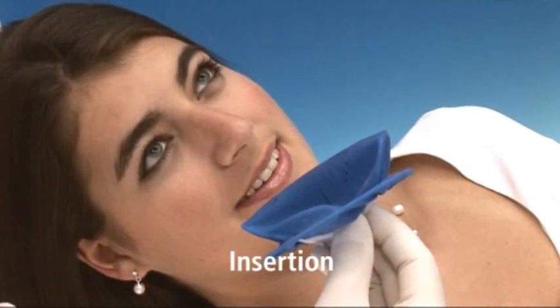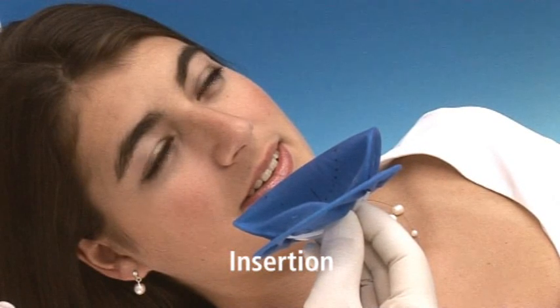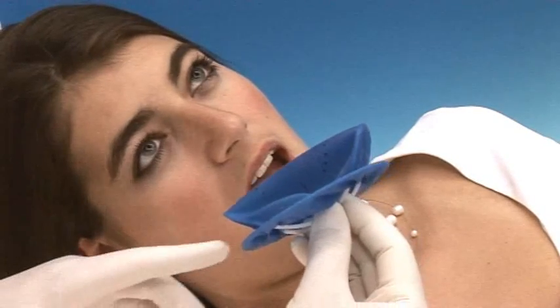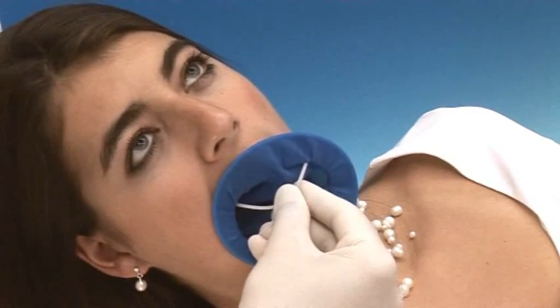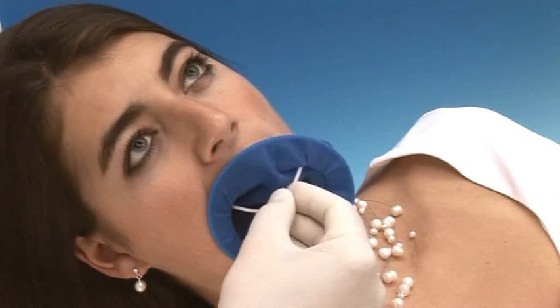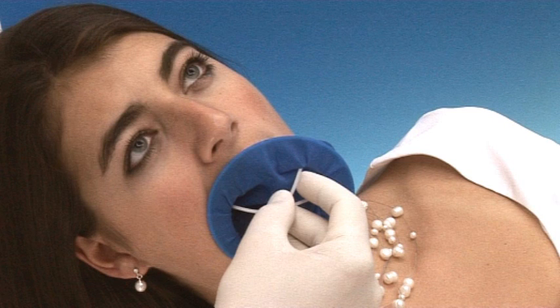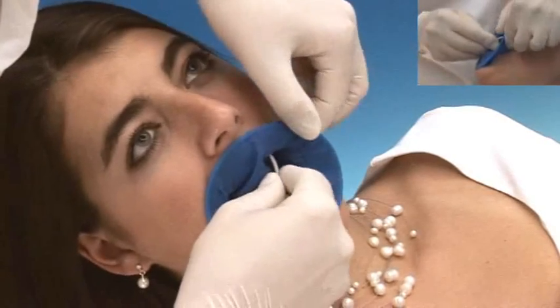Now the dam can be placed in four simple steps. During the first step, one of the two wings is placed as deeply as possible behind the first corner of the mouth. If this first placement is not deep enough, you will run out of space when placing the other side. In the second step, place the second wing behind the second corner of the mouth.